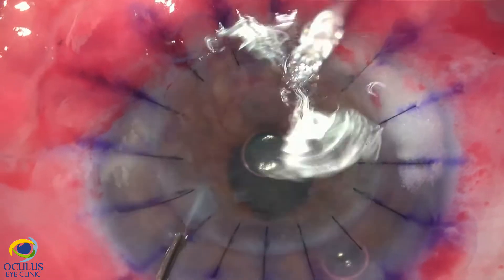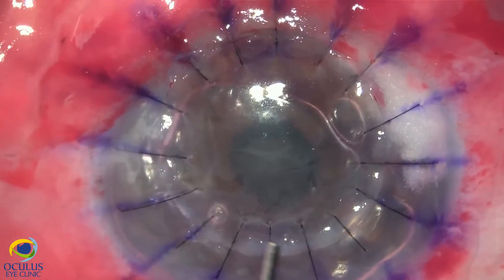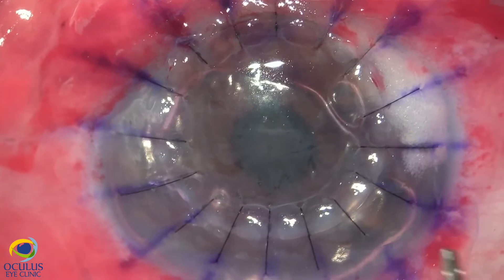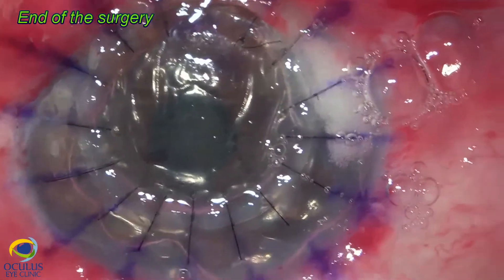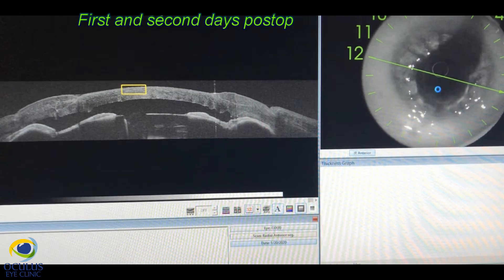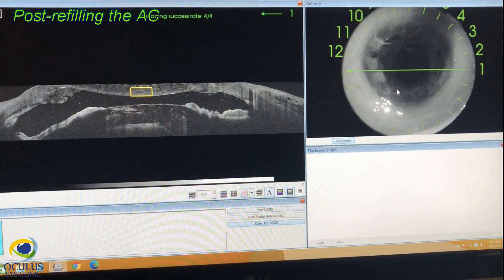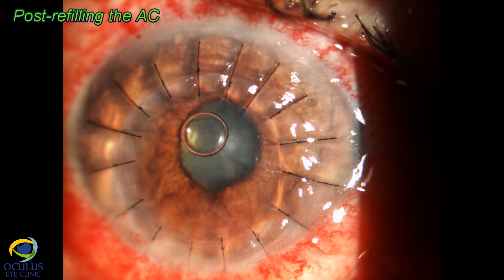One of the problems in this case is that after one month without any depth in the anterior chamber, the iris tends to come towards the cornea and it is difficult to preserve a deep anterior chamber. We tried both OVD and air; we managed to keep an anterior chamber with air, but on OCT the next day we saw synechiae between the iris and the cornea on 360 degrees, so we needed to refill the anterior chamber with OVD and air.